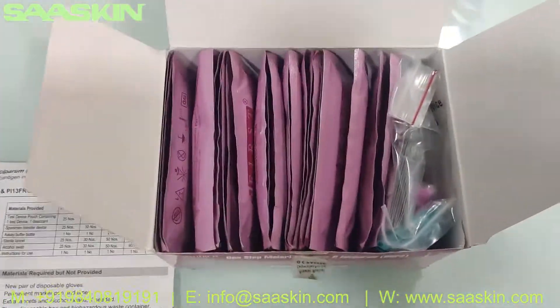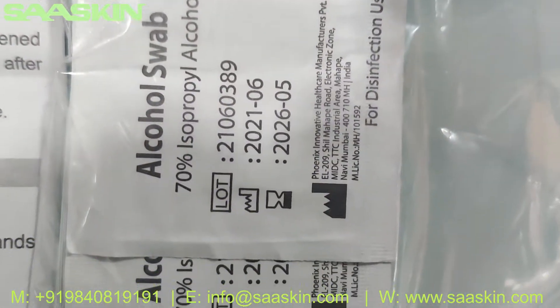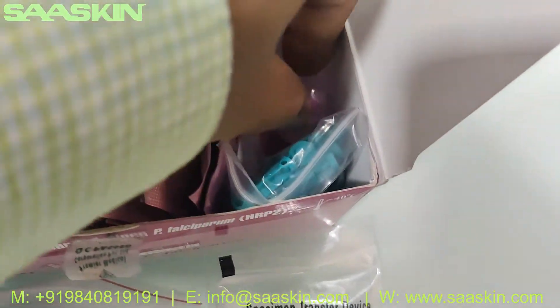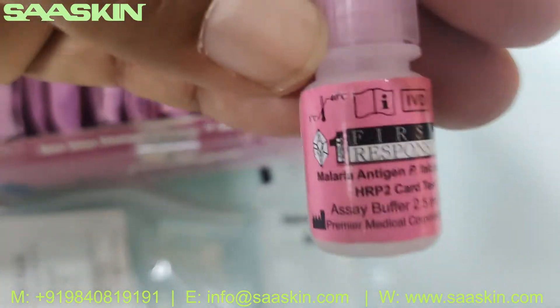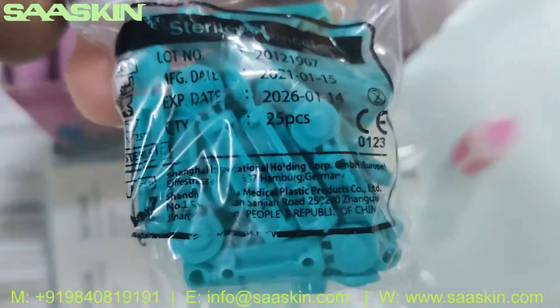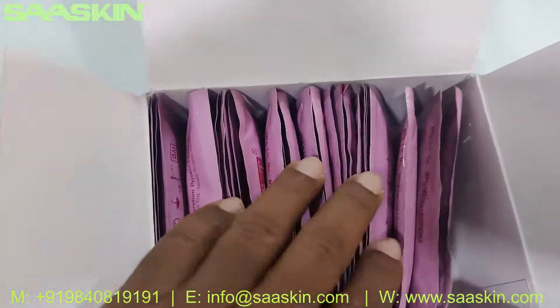Inside the box you get 25 alcohol swabs — 25 in a pack — and you get 25 pieces of specimen transfer device. Here you can see the specific transfer device, 25 numbers. You also get one buffer bottle — here it is, the Malaria Antigen PF Blood buffer — and inside you can see 25 pieces of sterile lancets. Here it is, and here you go, you got the 25 test cassettes.